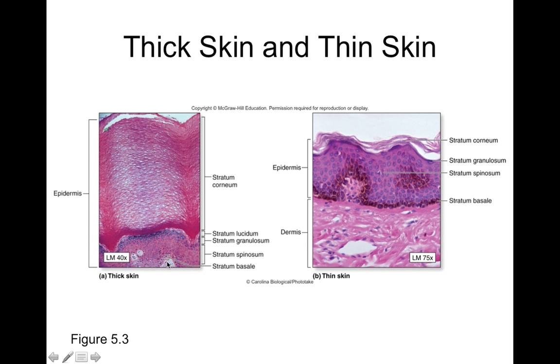So what you find in dermal papilla then are a lot of capillary loops, so blood vessels that can help nourish the epidermis, and a loose areolar connective tissue. You can tell it's loose because it even looks less dense. Like, see how it looks clear? Because there's a lot of ground substance and not a whole lot of cells and fibers. So it's more nourishing there.